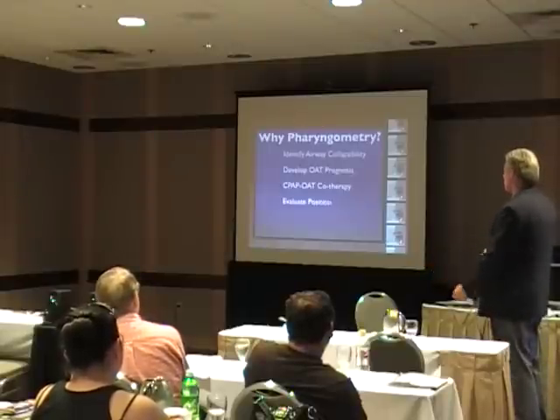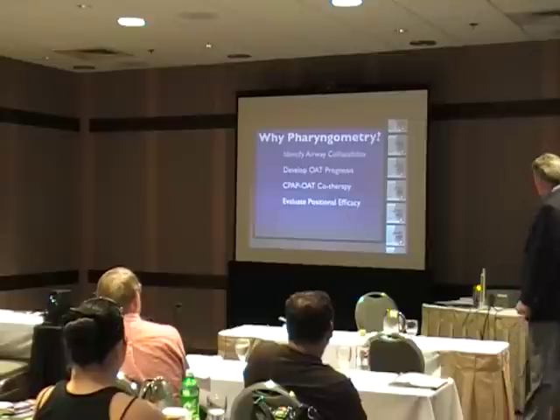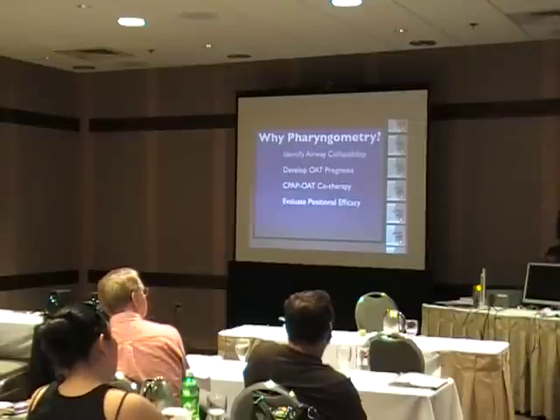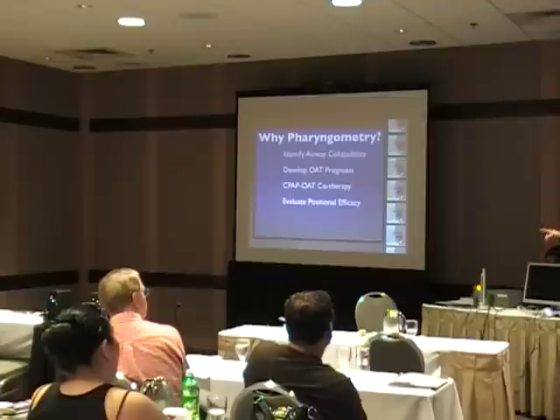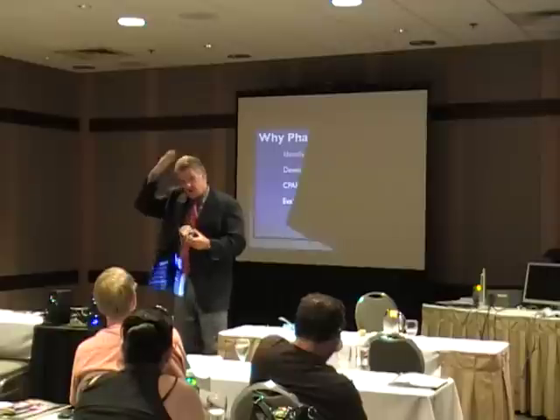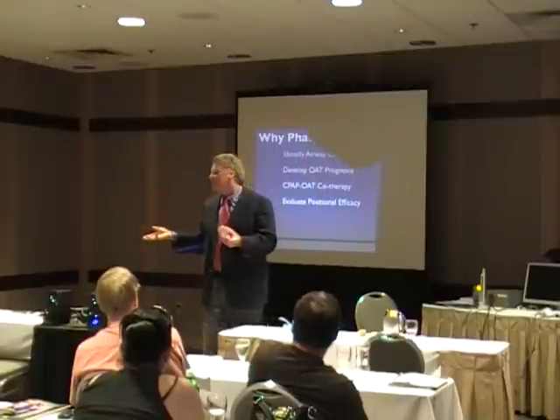Pharyngometry. All right, evaluate the positional efficacy. Showed you these little jigs, and these are really brilliant, okay? You can use different jigs, different sizes, and do different pharyngometric tests to see which vertical dimension might help the patient. Vertical. So how would you know how much vertical to add?